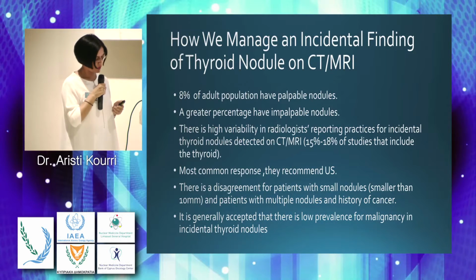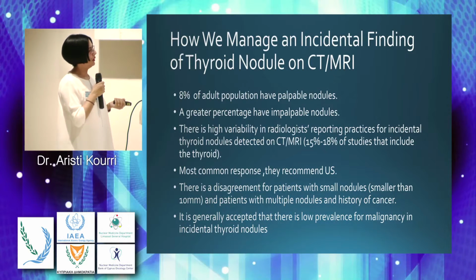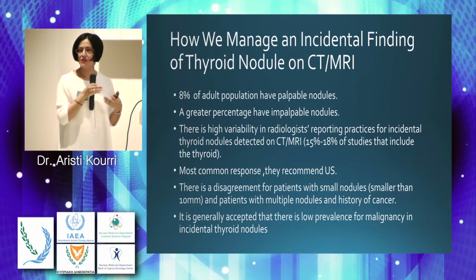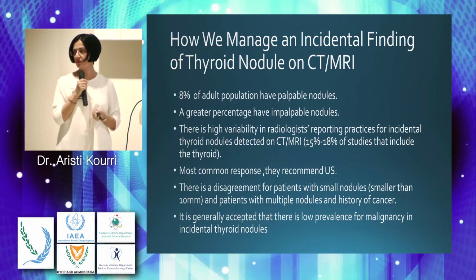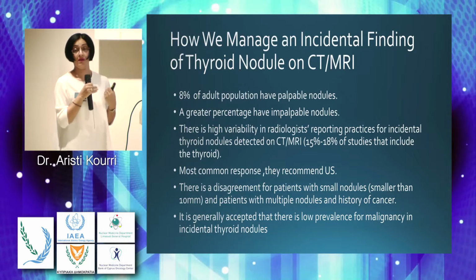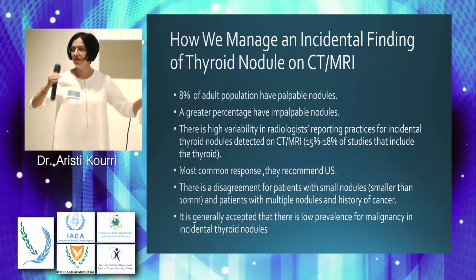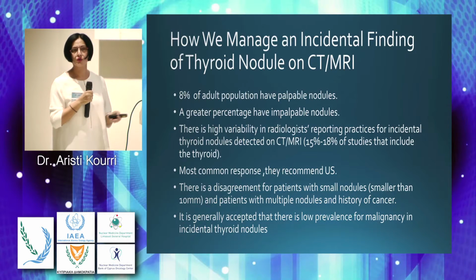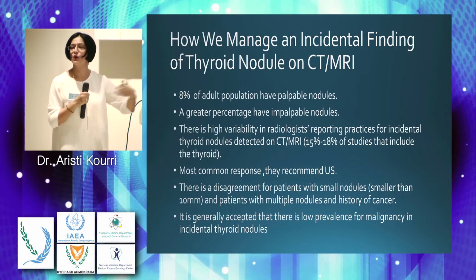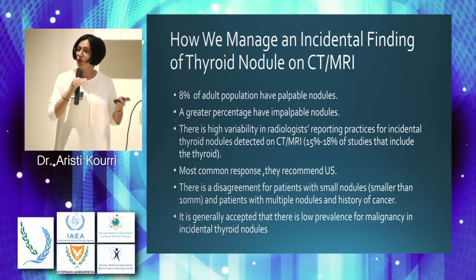Now, before I proceed to this slide, we are usually asked, why don't you do MR spectroscopy or MR diffusion-weighted images in every patient? Because of time and money. We have a patient that has a nodule, he has to know if he has cancer, and the histology of the cancer. You don't do every imaging method you have, because it costs and because you have to have a result about the histology to proceed with the therapy. You don't just do every imaging method you have in hand.